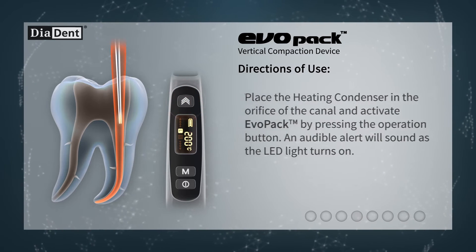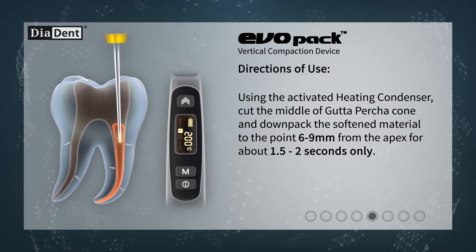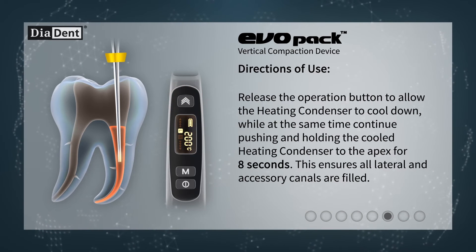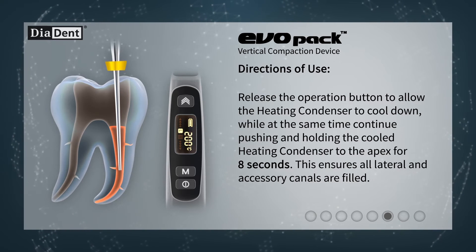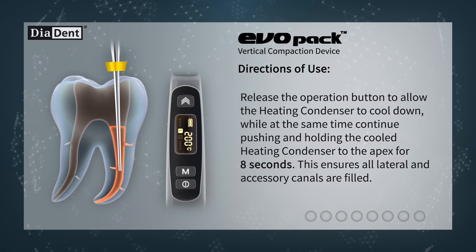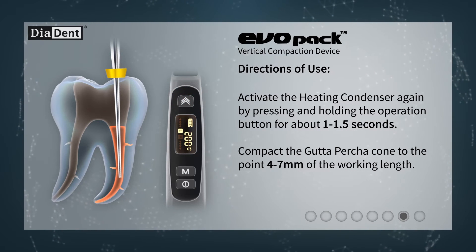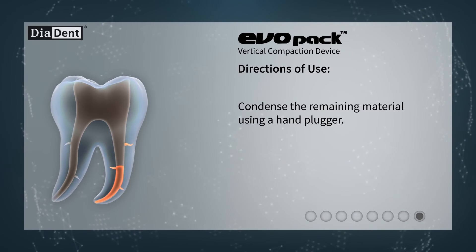Place the heating condenser in the orifice of the canal and activate Evopack by pressing the operation button. An audible alert will sound as the LED light turns on. Using the activated heating condenser, cut the middle of the gutta-percha cone and down pack the softened material to the point 6 to 9 millimeters from the apex for about 1.5 to 2 seconds only. Release the operation button to allow the heating condenser to cool down, while at the same time continue pushing and holding the cooled heating condenser to the apex for 8 seconds. This ensures all lateral and accessory canals are filled. Activate the heating condenser again by pressing and holding the operation button for about 1 to 1.5 seconds, and compact the gutta-percha cone to the point 4 to 7 millimeters of the working length.